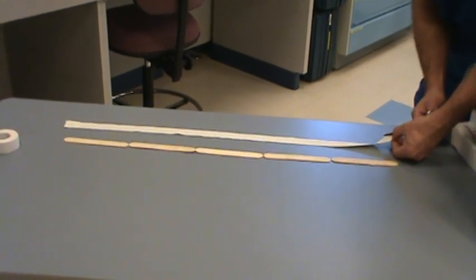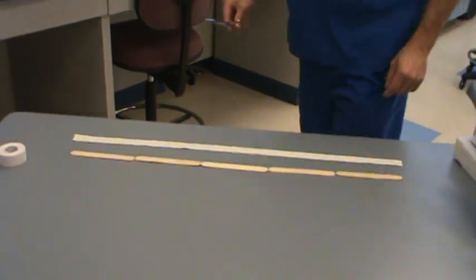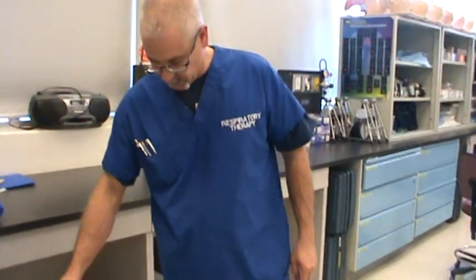So this is the first part that you do when building a set of tapes. All right? So there's our tape. We've got our tabs. The tabs are cut. It's roughly 5 tongue depressors in length.